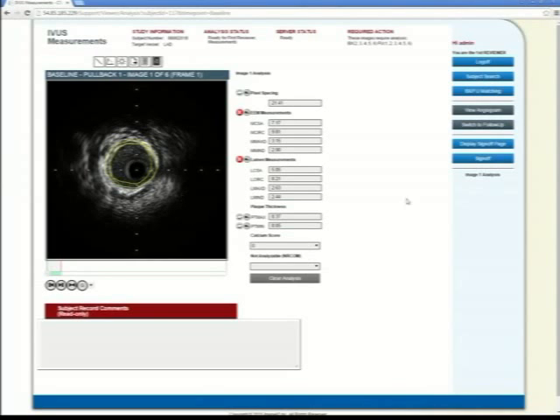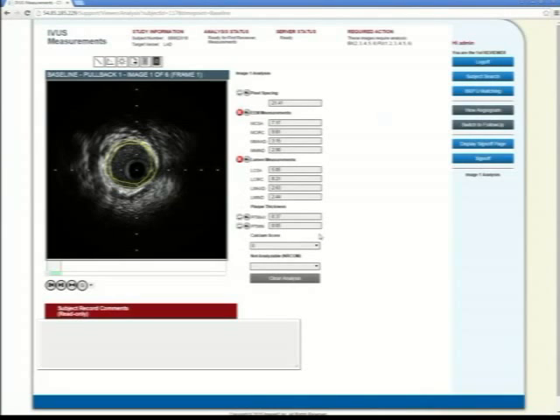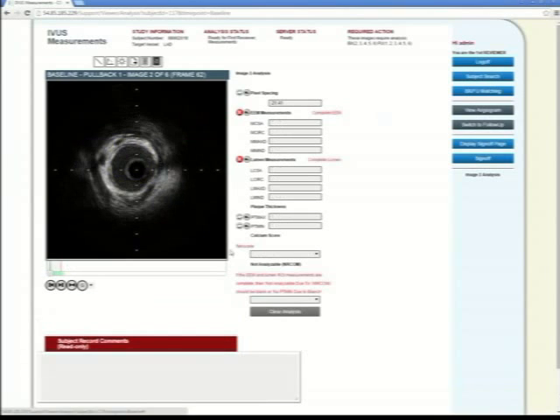Got it. Okay. And so then we sign off on that image. It shows us the images that are required for analysis. You can't sign off yet. So I can't sign off yet, but that's fine. That's good. So then it would just go from image to image throughout this to measure. I go to the next one, I go to the next one, until I finish that case, I sign it off, and then I do the follow-up. And that measurement experience is controlled, right? This is how you do the measurements, and so you get a more consistent product.